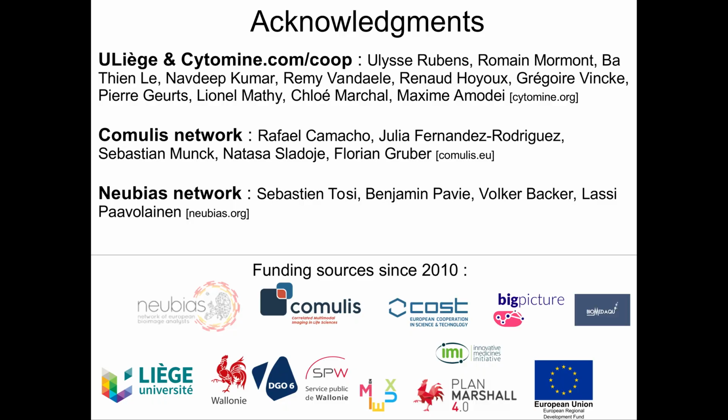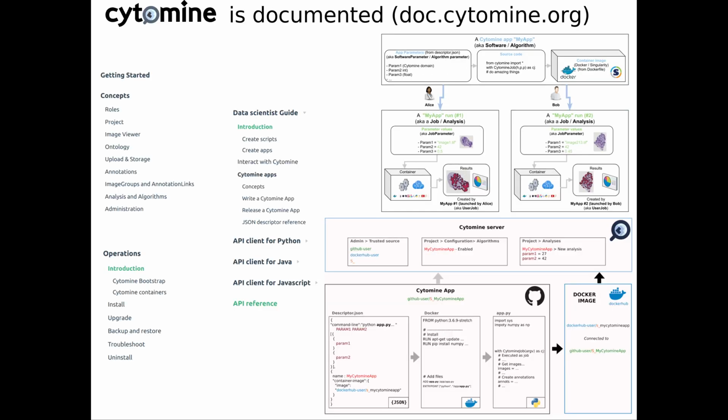So with this I would like to thank all my colleagues and the funding sources since 2010, and for those who want to start using Cytomine, it's quite easy. You can go to our documentation website where you have guides for administrators in the operation section, or for end users, where we describe all the concepts of Cytomine, and you also have a data scientist guide which will help you to develop your own app and plug it into Cytomine and then give access to your app through the web interface of Cytomine.